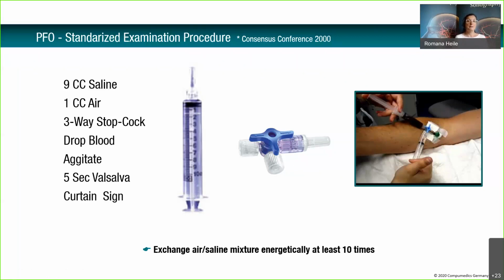In the very past, let's say when I started in the hospital, there was a chemical drug that was from the industry, but this is forbidden now. So nowadays, standard is really that everybody is using their own self-created bubble mixture. So it's quite of importance also for the doctors to know exactly how to mix it and to make sure that you get a kind of stable bubbles inside of this mixture in order to have a good result in finding PFO.